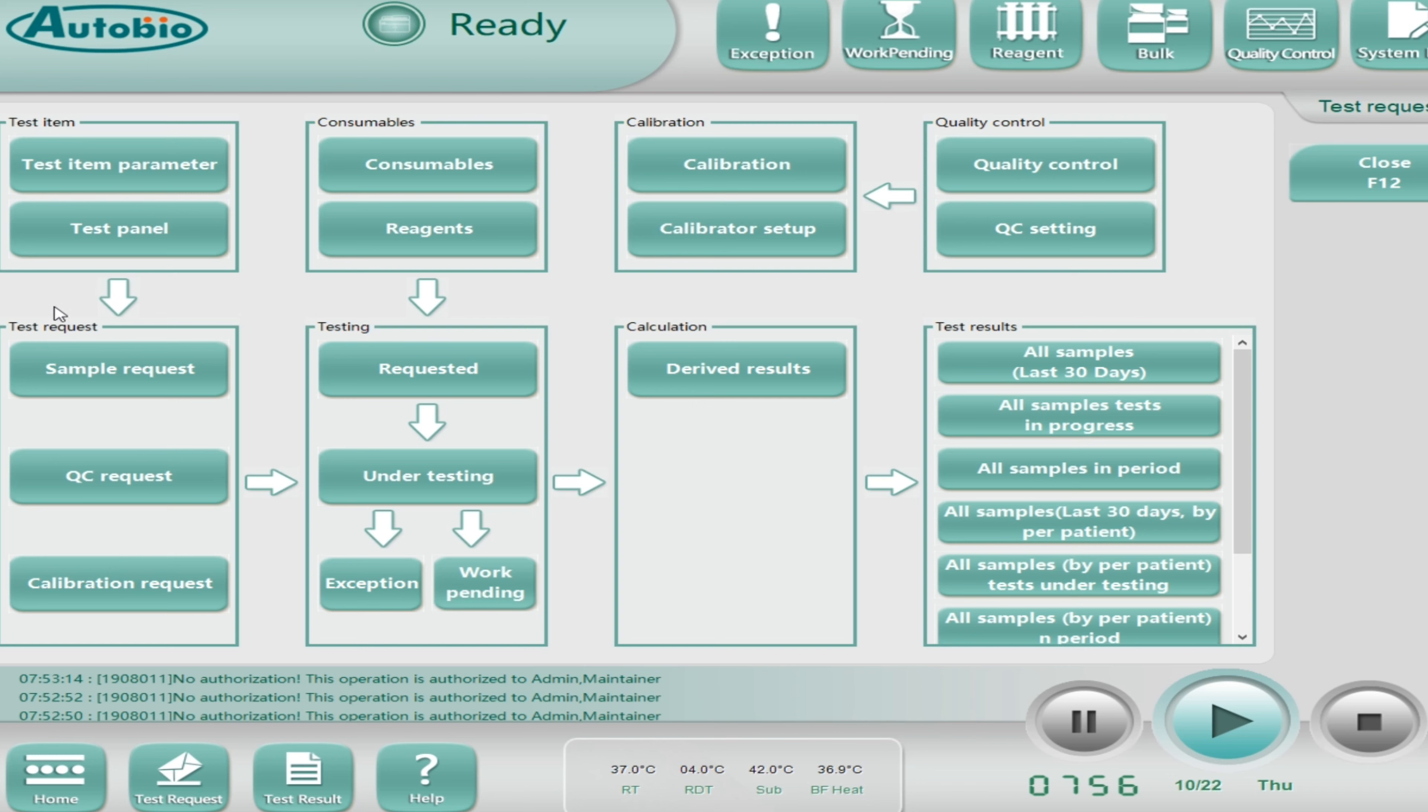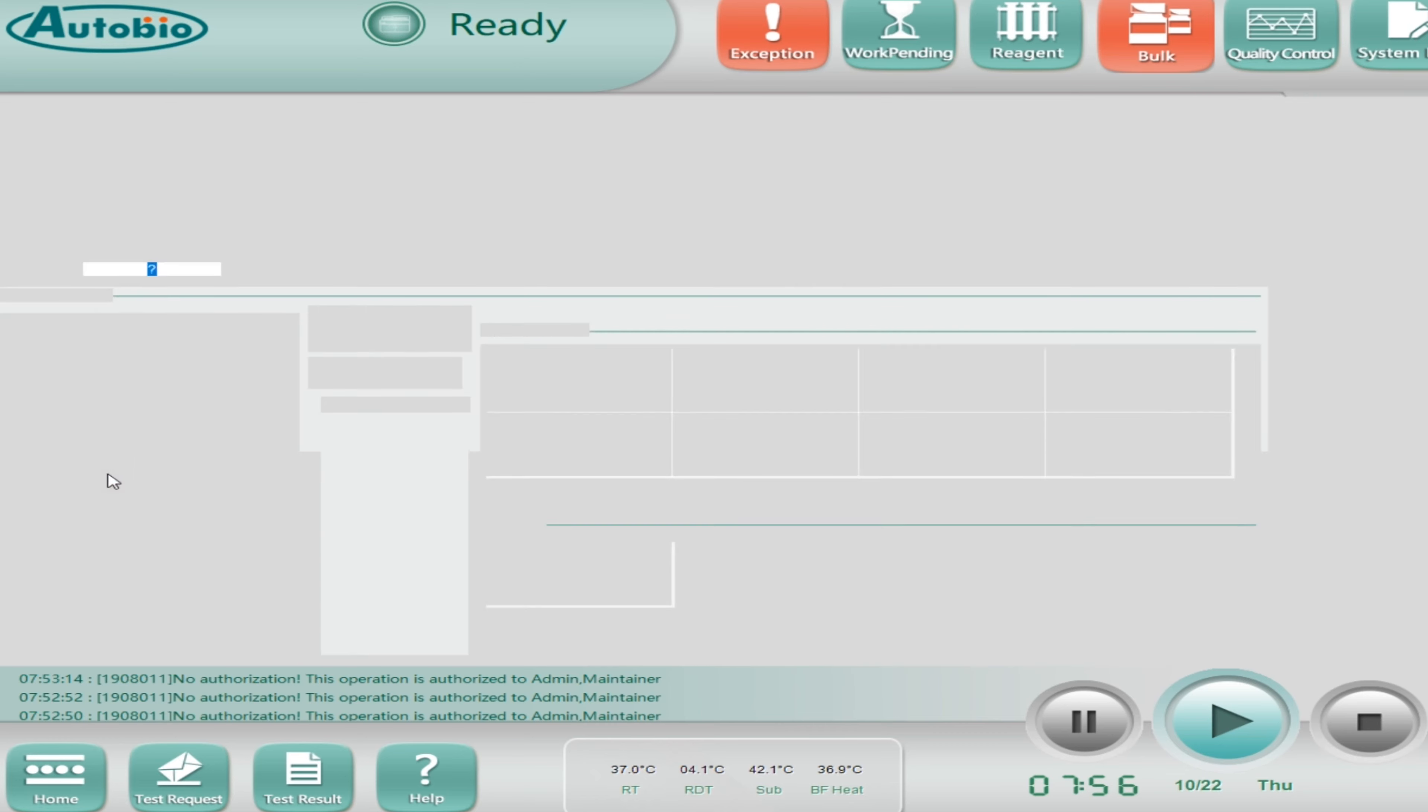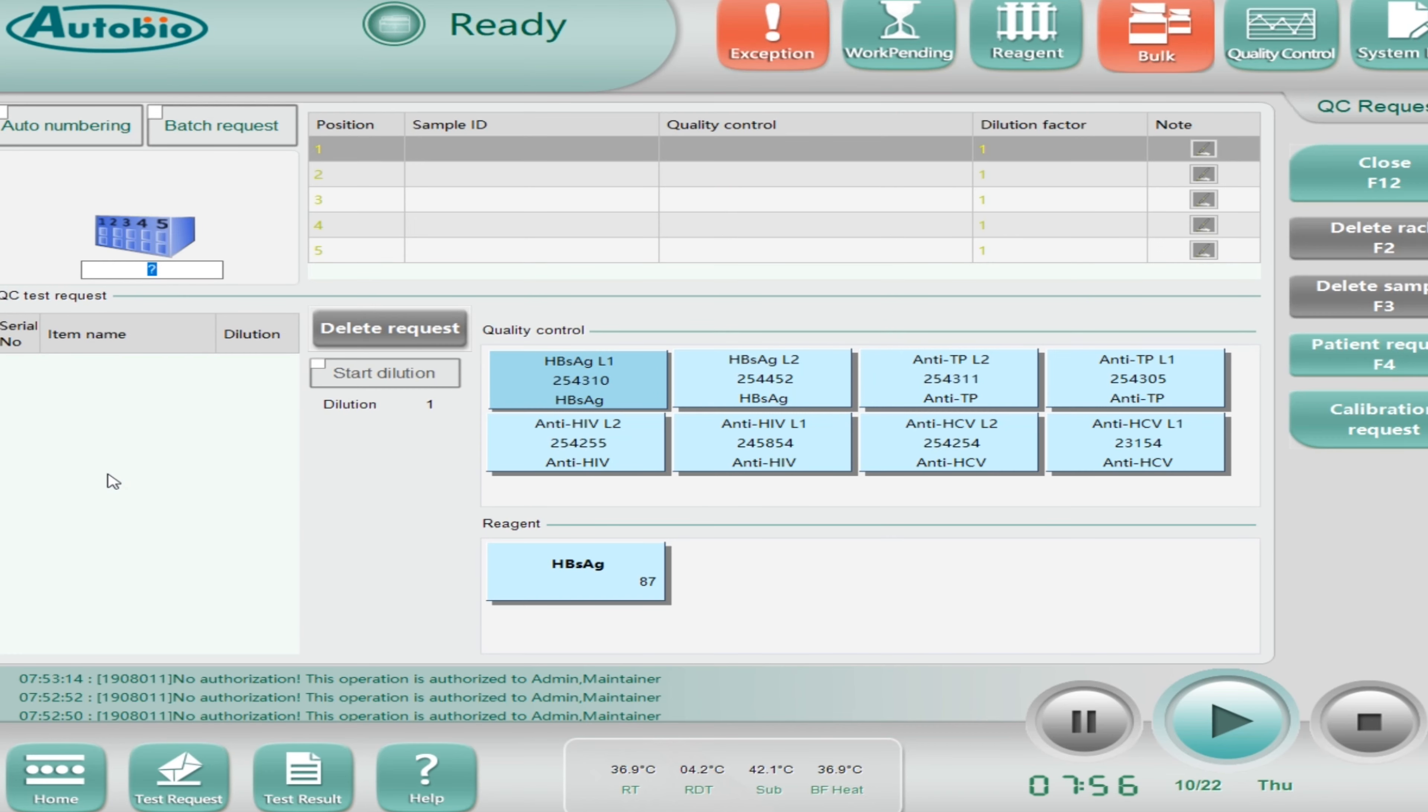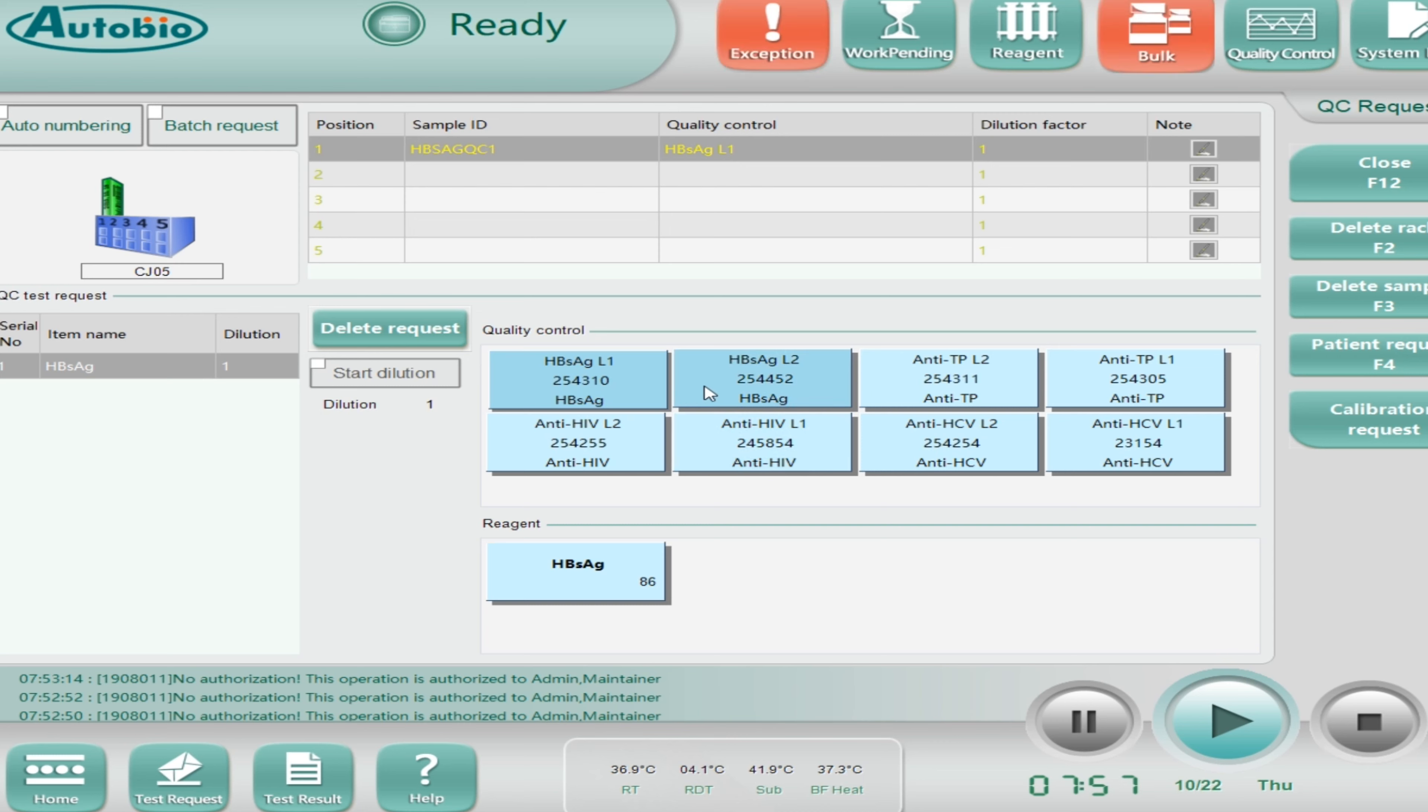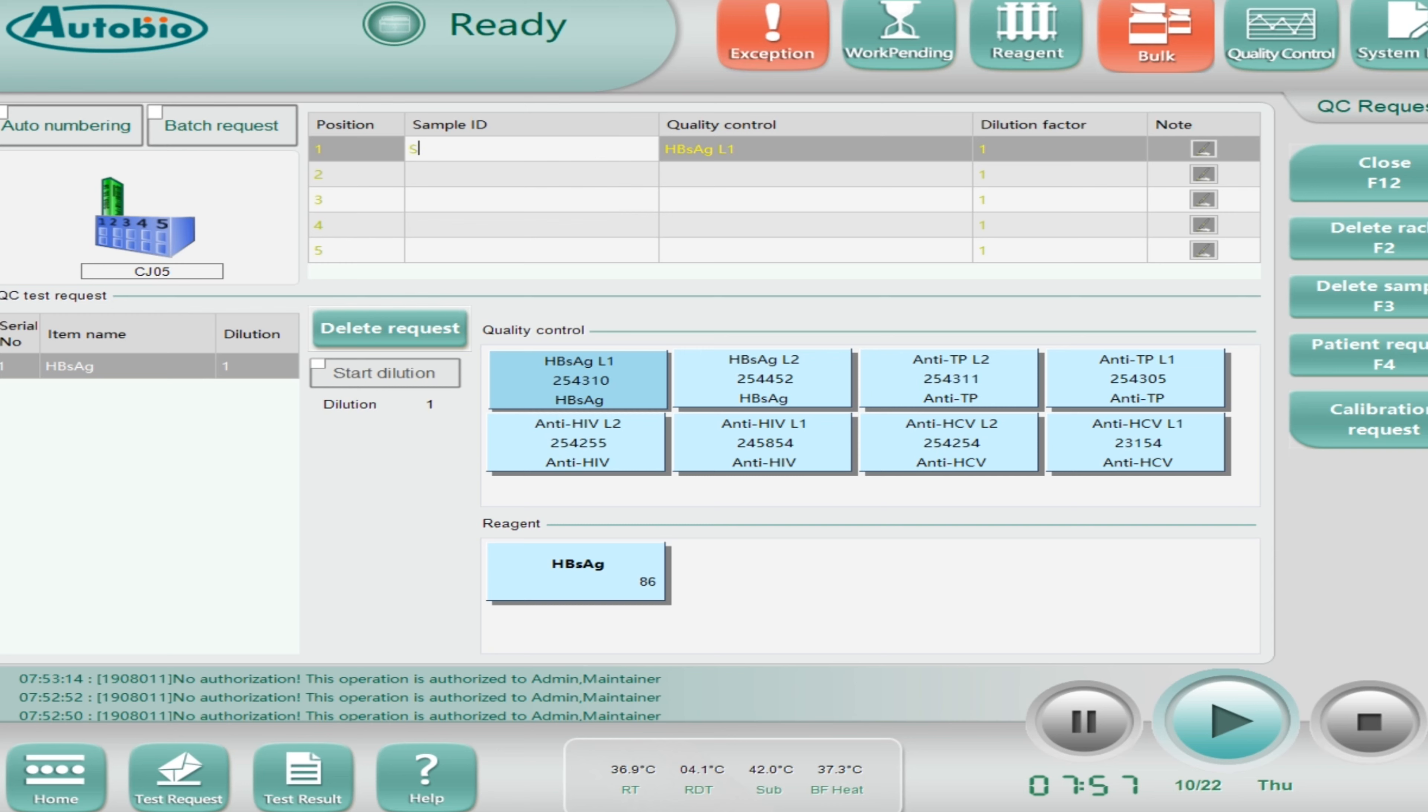And this one is consumables, same which I already showed you on the top in the bulk. This is the same thing. Next is reagent. It will show you the reagents like how many number of tests are remaining and its stability, when it was opened. And this one is test, test parameter. It will show you the programming of the test. And this one is test panel. If you want to make a profile by yourself, you can make profile as per your choice.